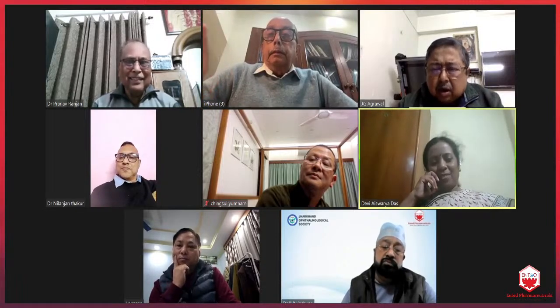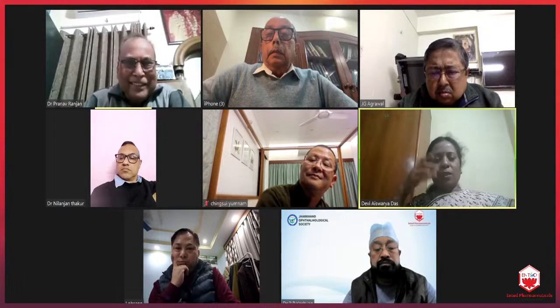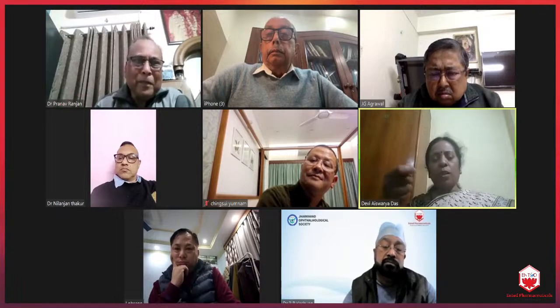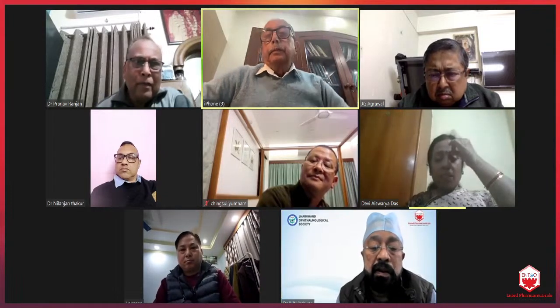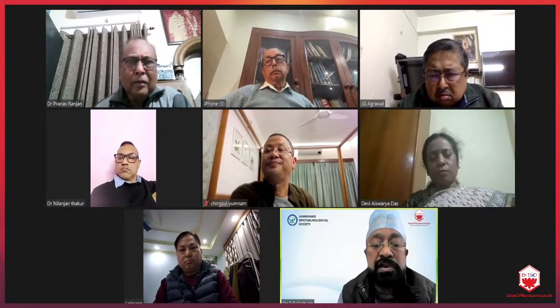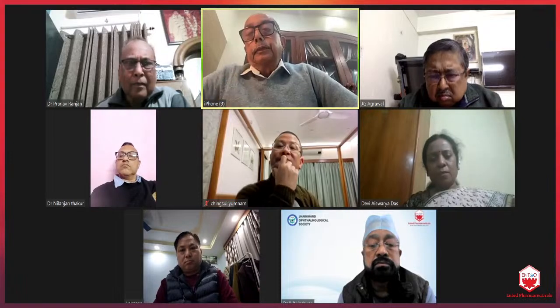Yes, anyone can join us. Dr. Ashwarya, you have an answer? So we can do the other eye measurement if this eye is not taking. If you can't measure here, or else we can just do a neutralization on table. Neutralization means refraction? Refraction, yes. So how do you calculate with the refraction, sir? The back vertex distance. What is it?